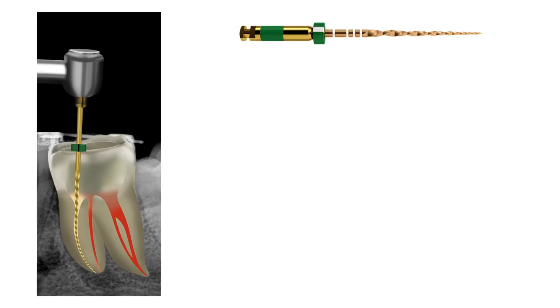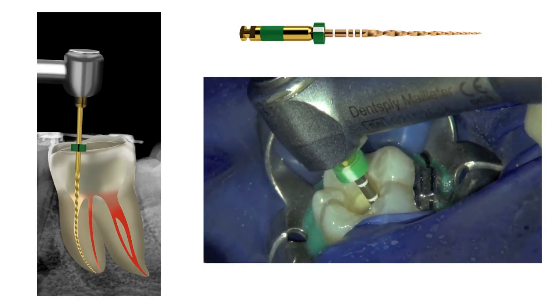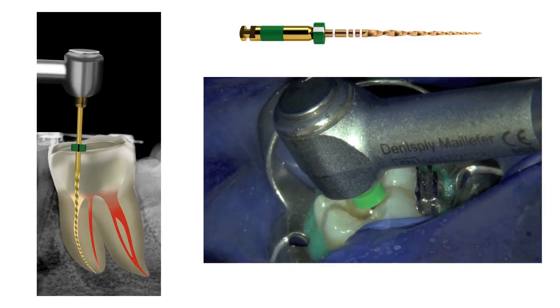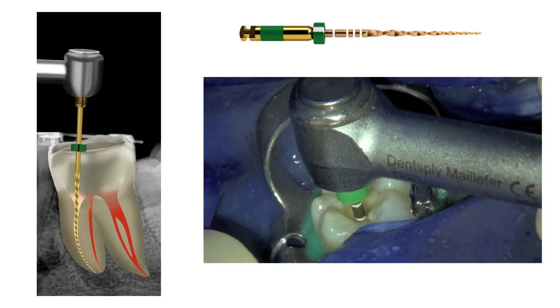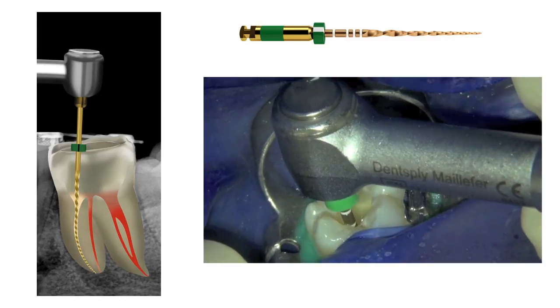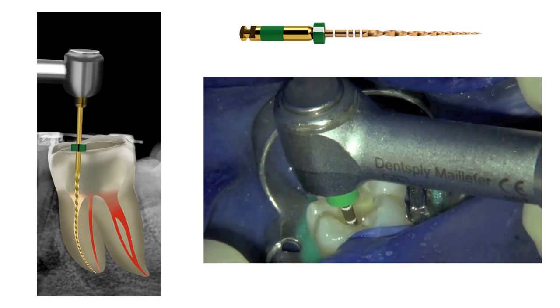A size medium WaveOne Gold reciprocating file was selected for root canal preparation, taking into account the size of the root canals. The access cavity was filled with 3.5% sodium hypochlorite and here you can see the preparation of the mesiobuccal and the mesiolingual root canals using the single WaveOne Gold reciprocating instrument.